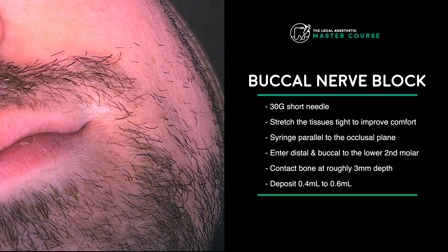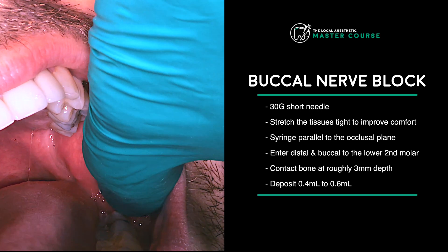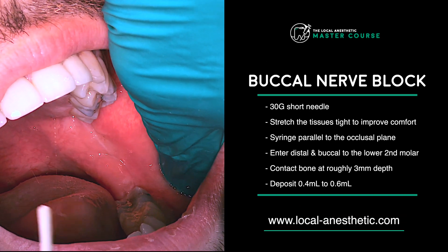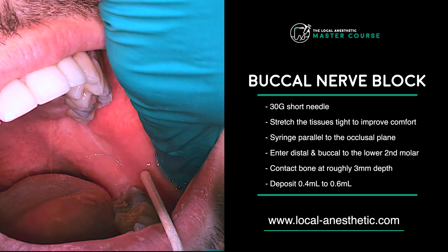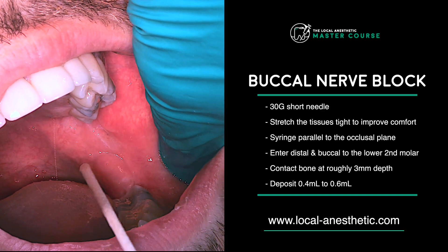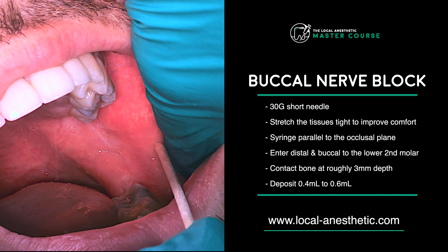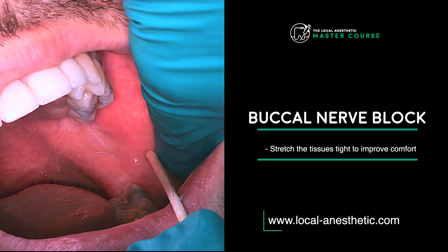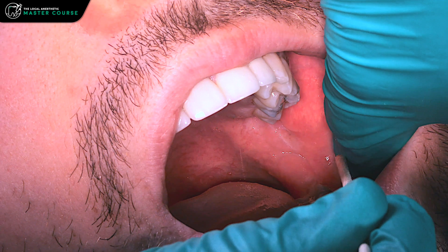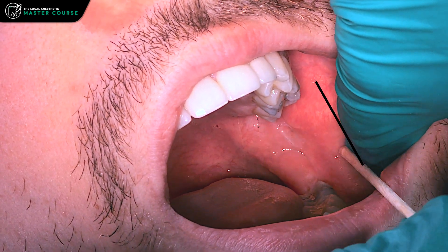We're doing a buccal block for a patient. We'll have the patient open, retract a little and pull to the side. We've got our coronoid notch where my thumb is resting, and we want to insert the needle parallel to the occlusal plane, just lateral to these molars — right over here. You're basically inside that anterior ridge of the ramus and a little bit lateral, almost bisecting those two.